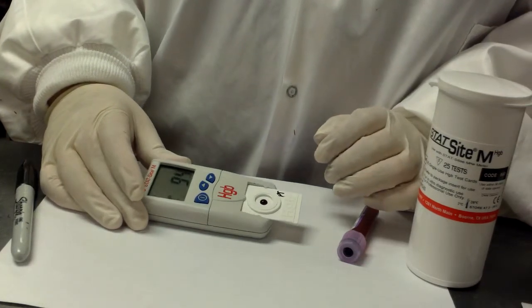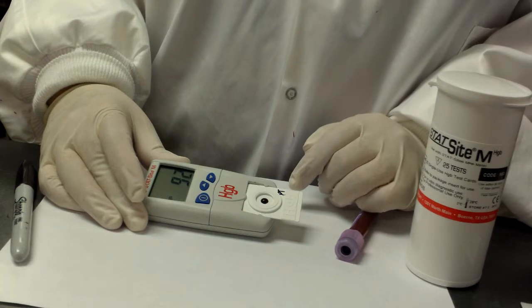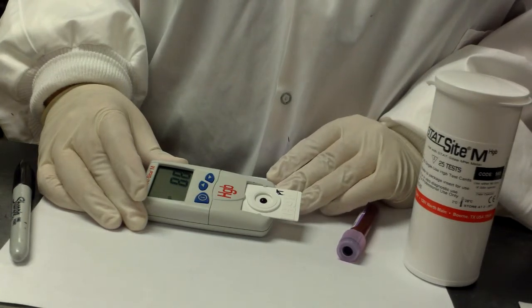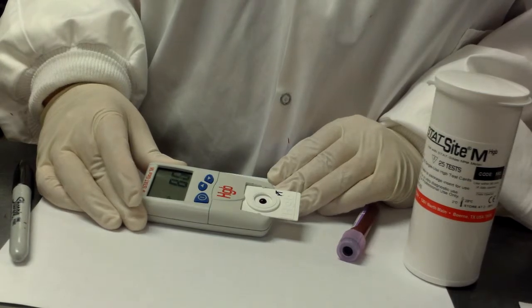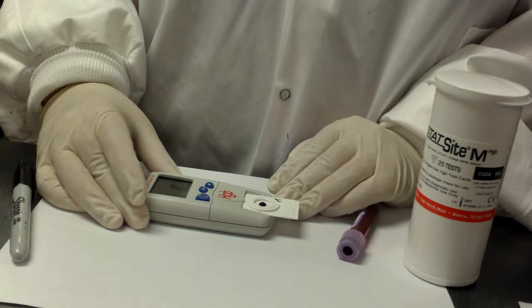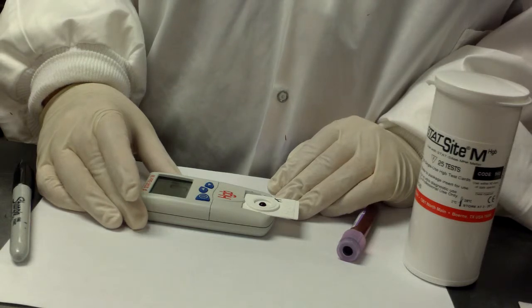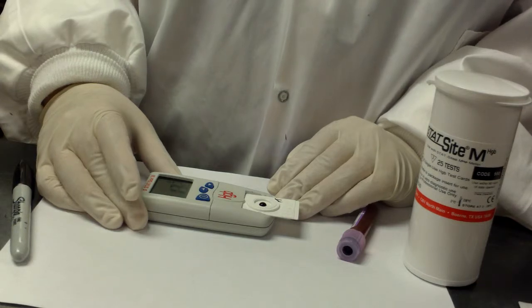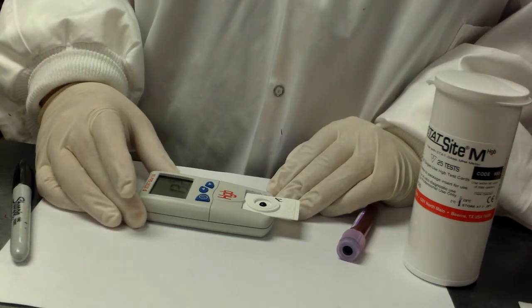It's a very simple instrument. There's not much to it. There is an operator's guide that goes with it, but pretty much it's idiot friendly. And my hemoglobin is 13.2.